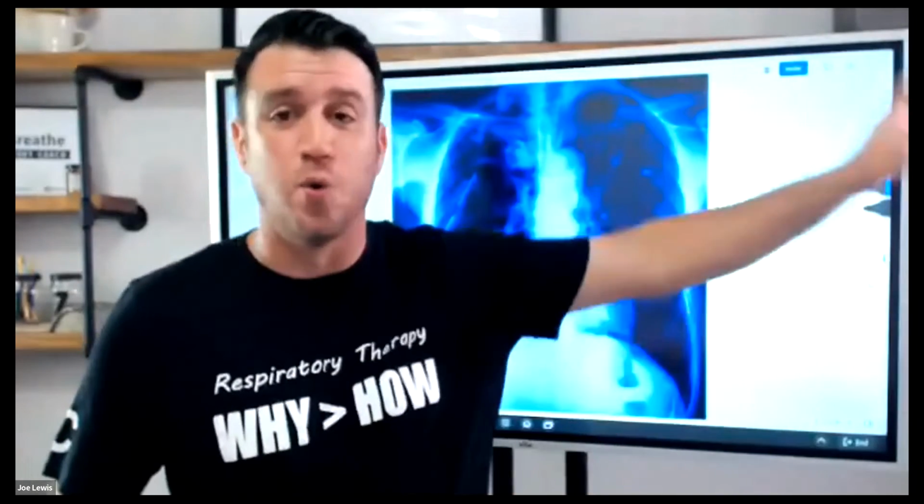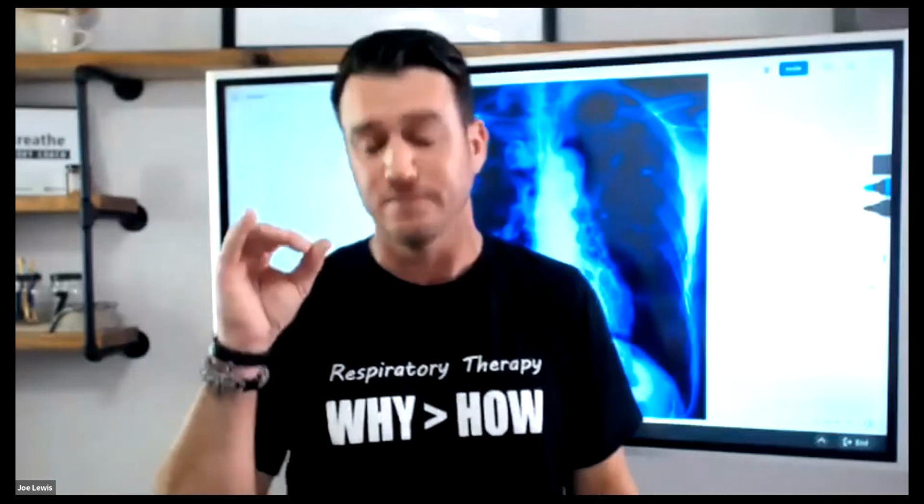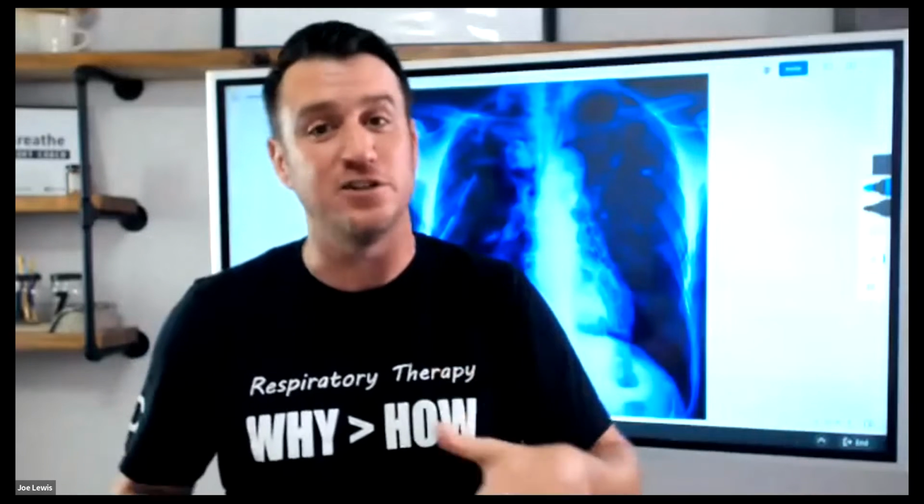Well, the ARDSNet protocol told us 20 years ago that plateau pressure is the indicator, right? 20 years ago, it said, hey, plateau pressure less than 30 centimeters of water pressure, use appropriate size tidal volumes, 6 to 8 mLs per kilogram to prevent barotrauma, and utilize this new method of mechanical ventilation. But you know what's funny is in 2015, roughly 7 years ago, they came back and said, you know what, maybe it's not plateau pressure.